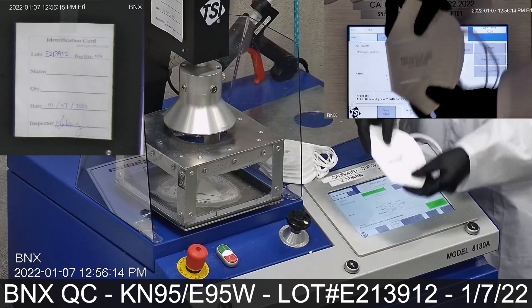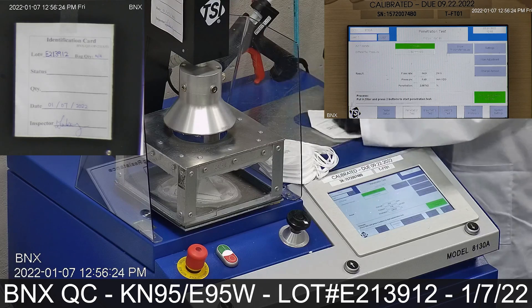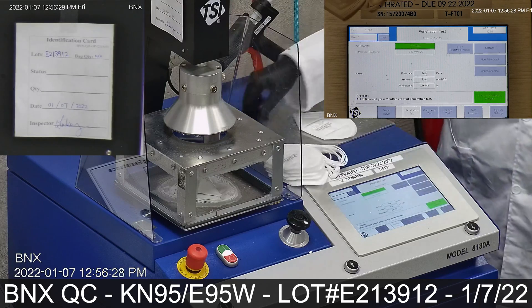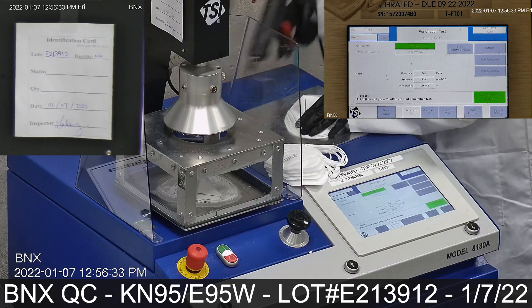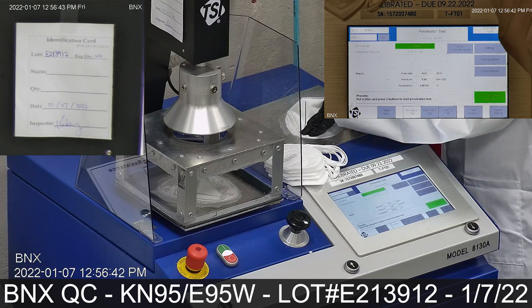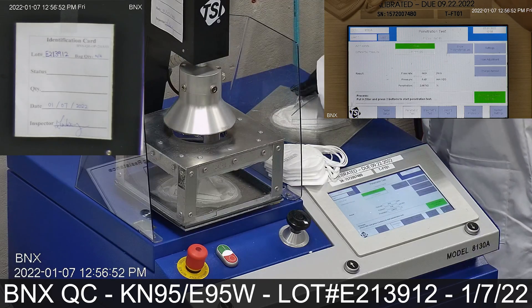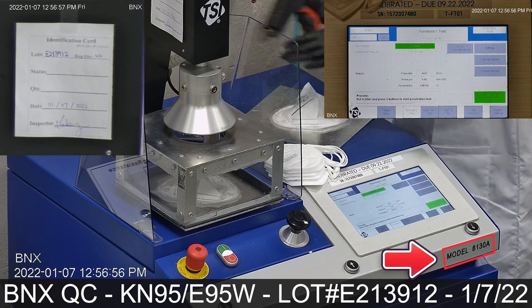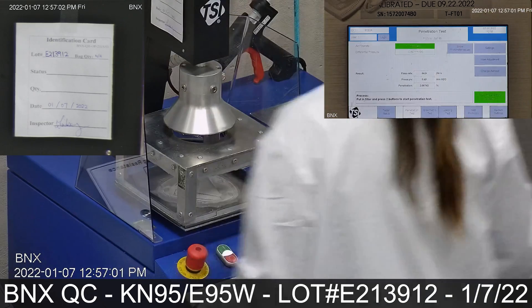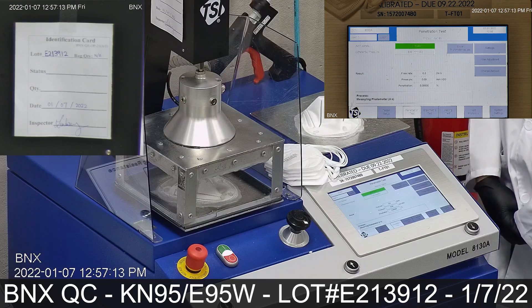The procedure in this video was performed to evaluate particulate filter penetration on BNX protective masks and filtering facepiece respirators. The filter tester used is a TSI model 8130A automated filter tester, capable of efficiency measurements of up to 99.999%.